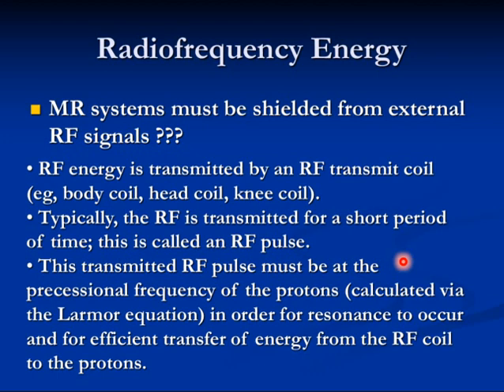How do they shield it? There is a special kind of cage called a Faraday cage. They just surround the magnet with a Faraday cage and there will be no radio frequency waves inside. When you go in, you'll be out of service. Your mobile will stop. No signal at all.